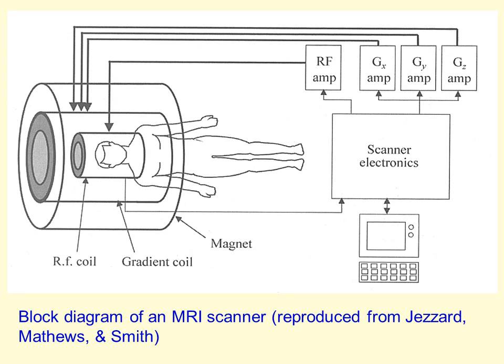The first is the magnet, the static magnetic field that's turned on all the time, even overnight when there are no participants in the scanner. In the 3 Tesla MRI scanner that we have here in the Centre for Integrative Neuroscience and Neurodynamics at Reading University, that 3T magnet is 50,000 times the strength of the Earth's magnetic field.